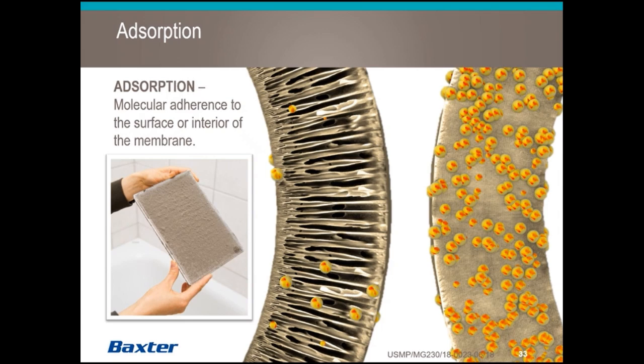Eventually, the impurities will clog the filter and it will need to be changed. The same is true in blood purification. High levels of adsorption can cause filters to clog and become ineffective. However, not all filters or all membranes possess this adsorptive quality. To predict whether adsorption will play a role in the clearance of a specific substance, it's necessary to identify the specific properties of the membrane and the targeted molecules, although we will not go into this today.